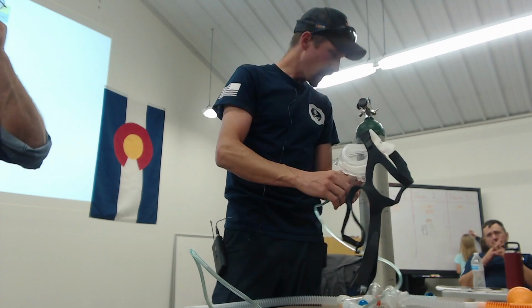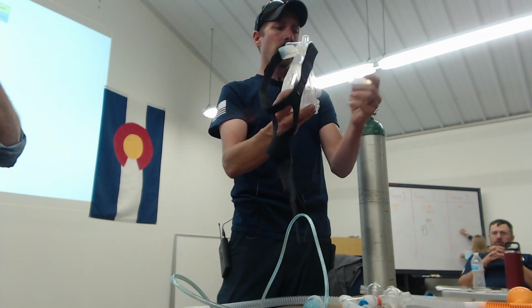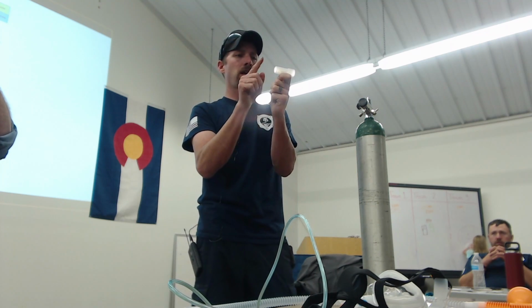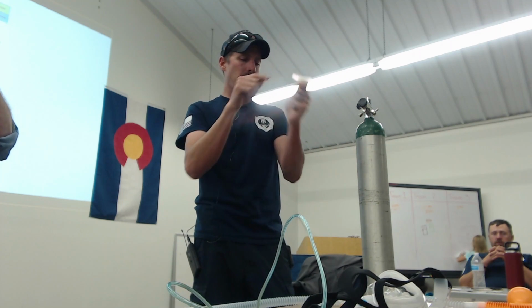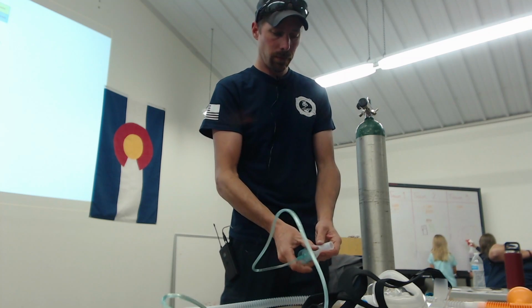How about CapnoTyler, Tyler? Capnography, same thing. I didn't grab a capnography adapter, but all these little parts are universal, and the capnography adapter pretty much looks identical to this little piece. It's going to have your male and female side. You can add that into there, and then just run your sampling line back to your monitor. Make sure that you actually turn the capnography on so that it starts that pump on the monitor. Super important. If we're going to be trying to assess our patient with this, we need to have that capnography on.